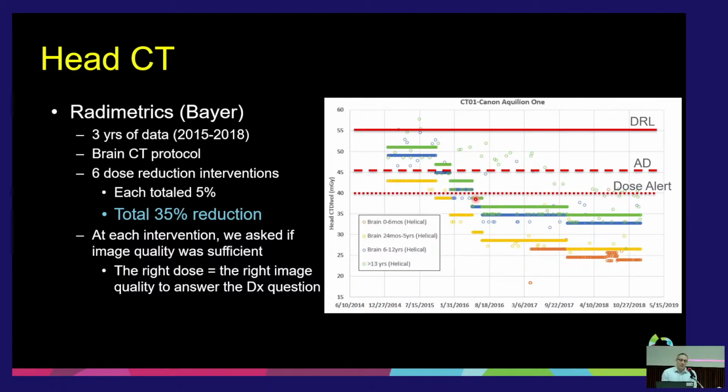And it's worth pointing out, and I don't have the data, but this is kind of a U shape. We've actually brought the dose up. This was before my time, so I didn't make those decisions. When the radiologists came in, at this level, they initially said, we're comfortable with this, but with time, I started getting more and more complaints. And I said, okay, you're not comfortable with this. And so we actually brought the dose back up. So ours looks like a U right now. But that's a good point, and thank you for clarifying that. And that's a great example of how DRLs can help.